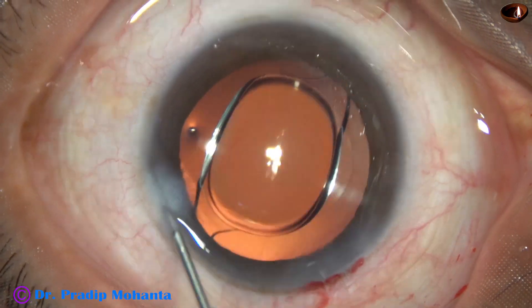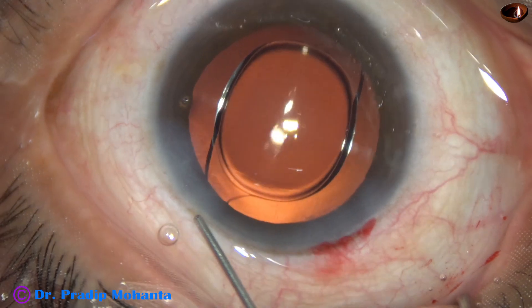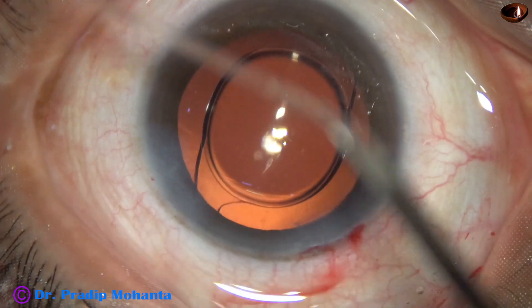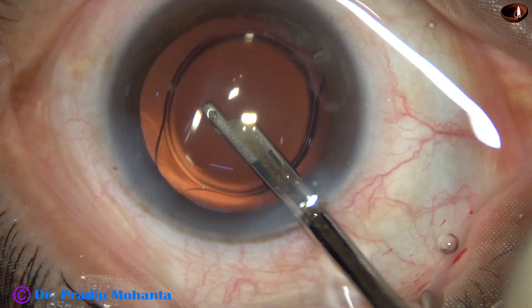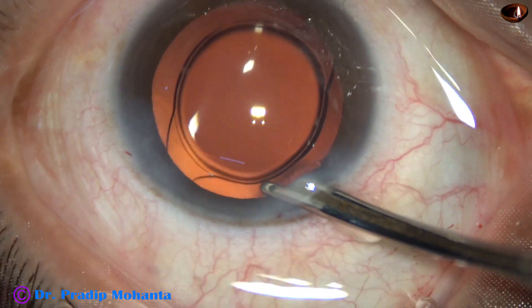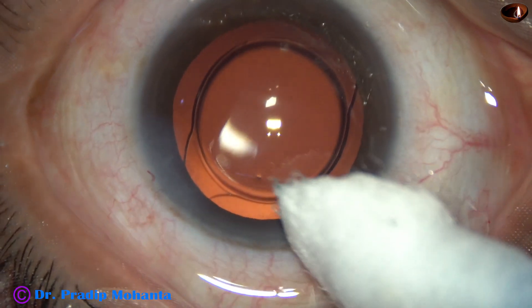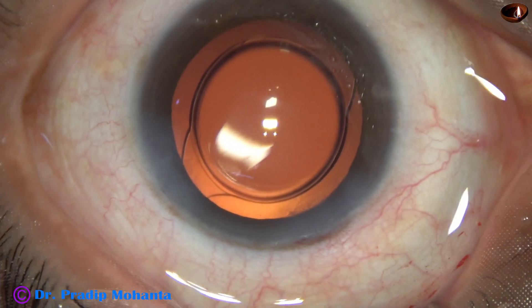Now the side port is closed by hydrating the corneal stroma on either side of this step wound. This is the final lavage of the anterior chamber, and the anterior chamber is nicely formed. The integrity of the wounds is checked with a cotton-tipped Johnson & Johnson bud. A few drops of moxifloxacin are applied over the corneal epithelium, and the case is concluded.